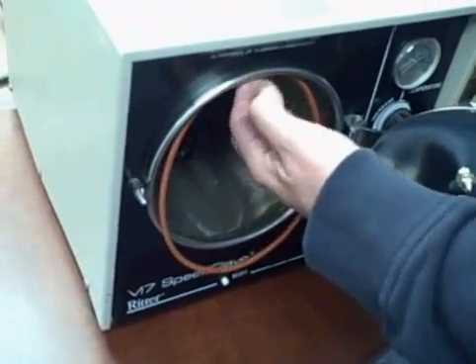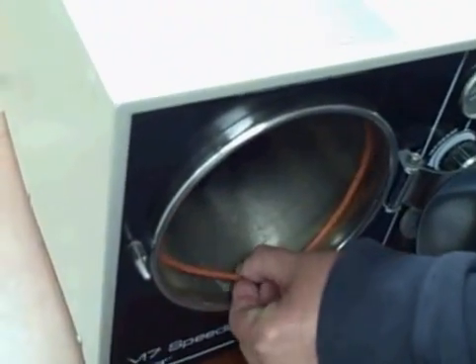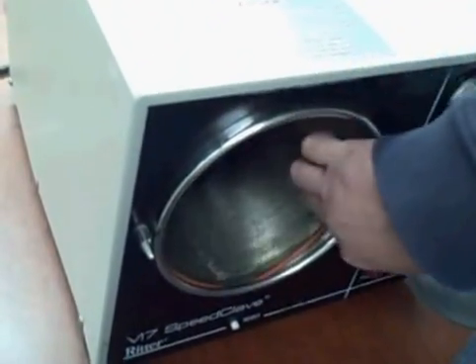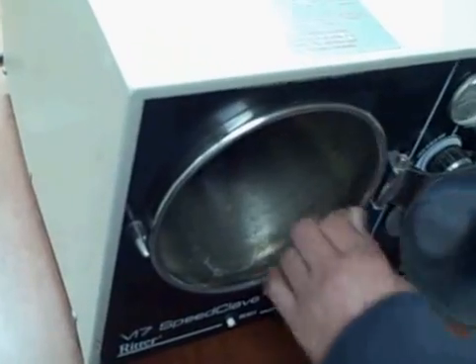You want to start at 12 o'clock, insert it, and then take half of what's left over and insert it at 6. And just keep doing it in halves. 9 o'clock, 3 o'clock, and just keep working around it until it's all the way in.